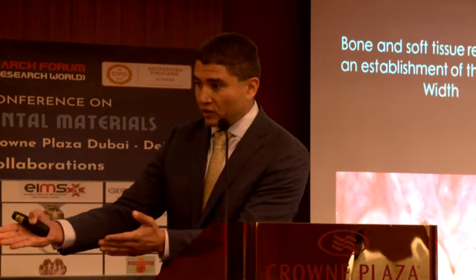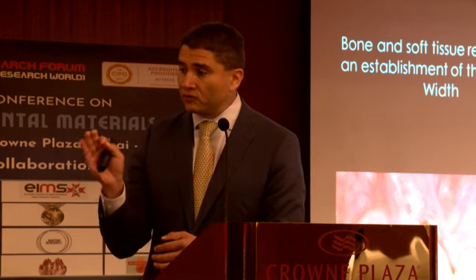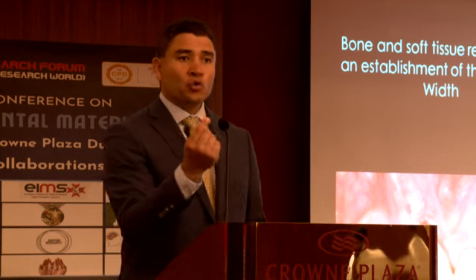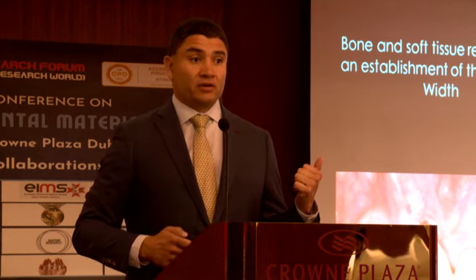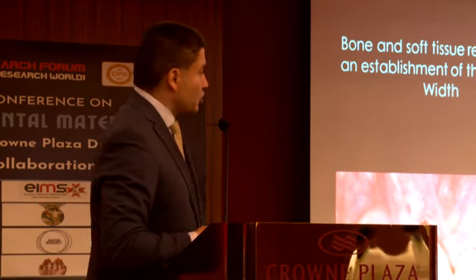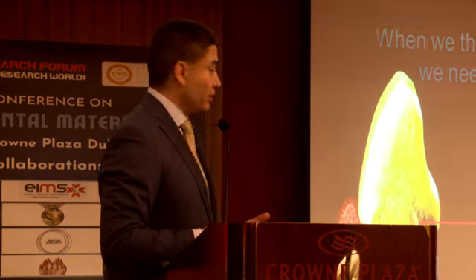You explained it early on today. Very, very well explained. You put a connective tissue graft to increase the soft tissue thickness around the implant in order to what? In order to better protect the biologic width. In other words, that's exactly what you did, right? And very rightfully so. So the soft tissue thickness and the bone thickness are important elements for bone remodeling, right?